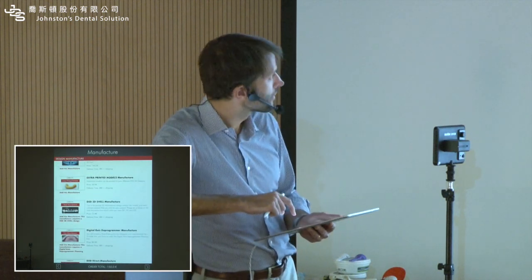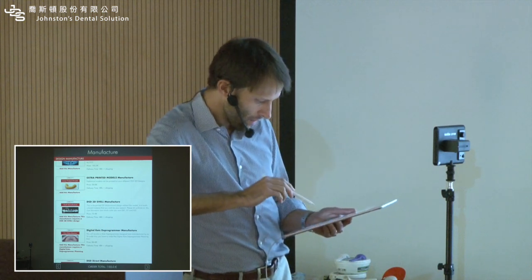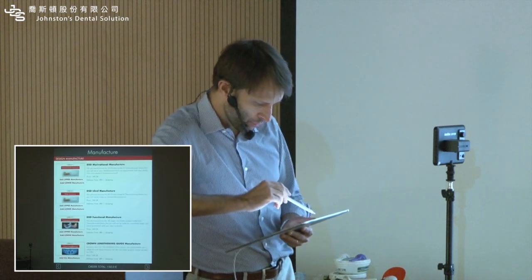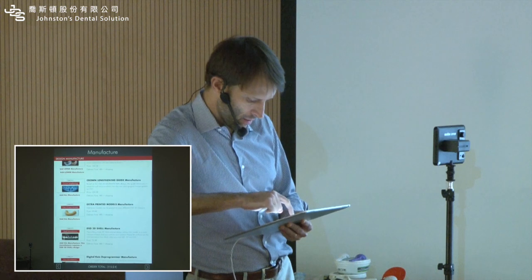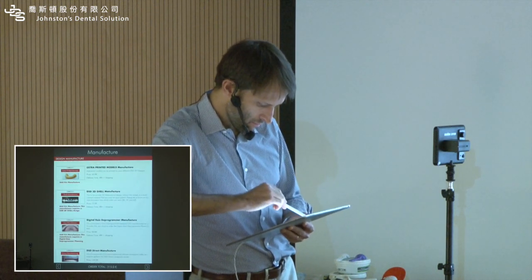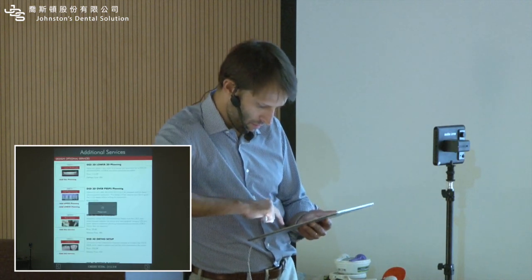Here we go. The shell. Okay? So let's say I want also to print the upper model and I want to print the shell. Christian, you have to select in this additional service. Yeah. Design. Here we go.